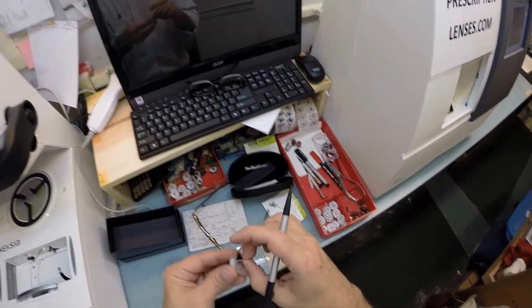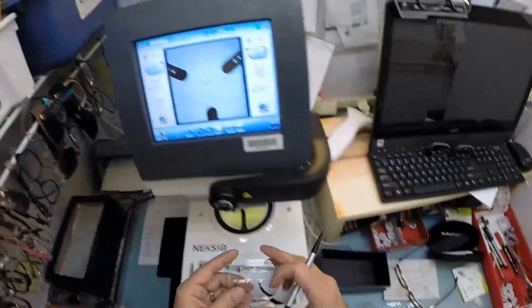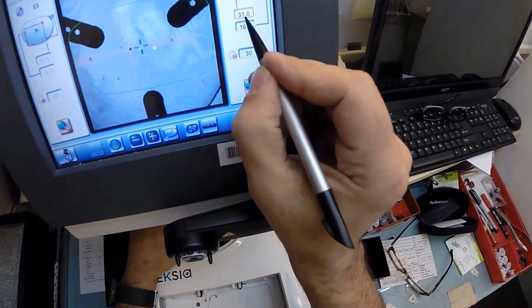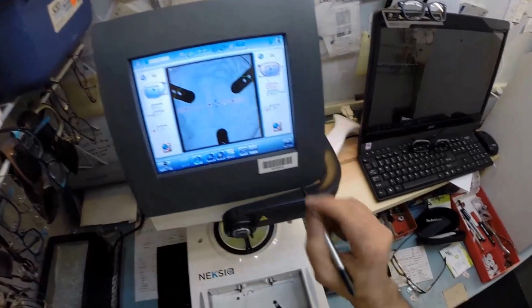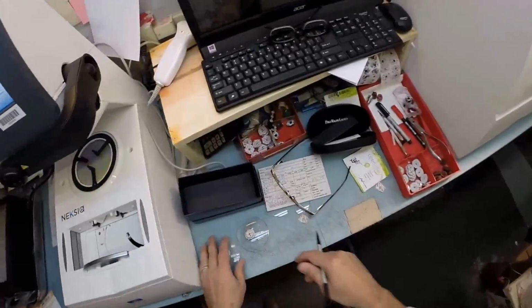Pull away the paper to expose the second pad, and we're going to do the same thing for the left lens. Get that lined up in there perfectly. Again, the pupillary distance is 31. I programmed that in there just a little while ago. Remember, we covered this. You didn't know you were going to be tested on this, did you? And hit the button again, the arm comes down, the block gets applied to the left lens.